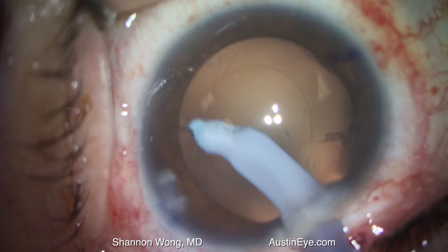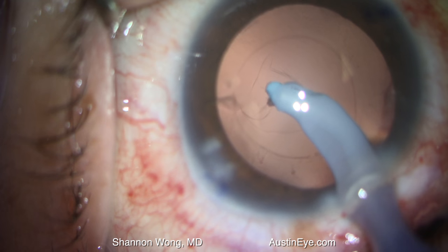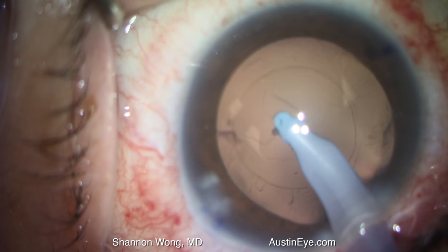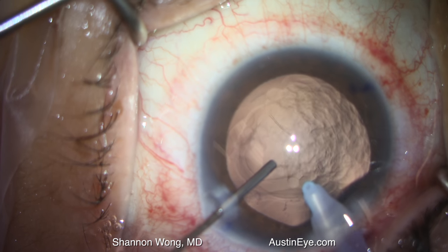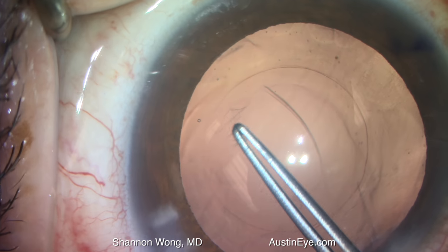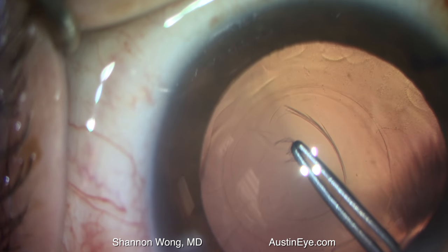The posterior capsule then ruptures, and then we fill the anterior chamber with viscoelastic, and perform a posterior capsulorexis using Utrata forceps.